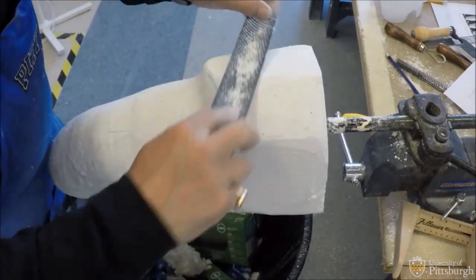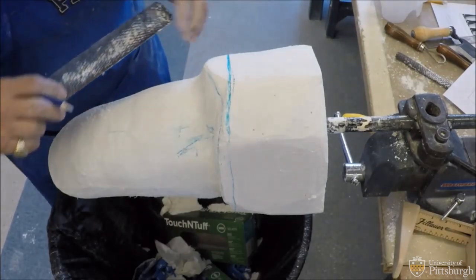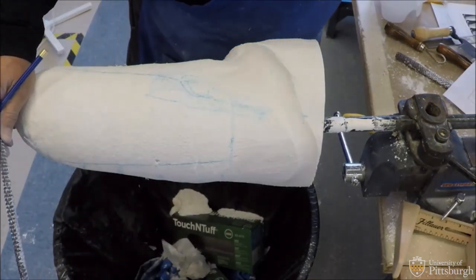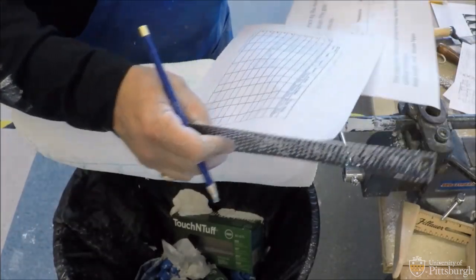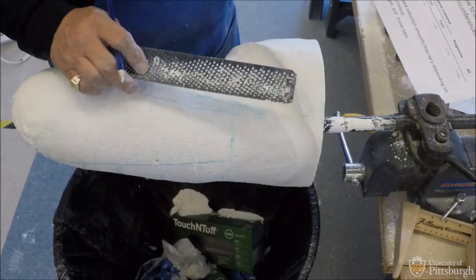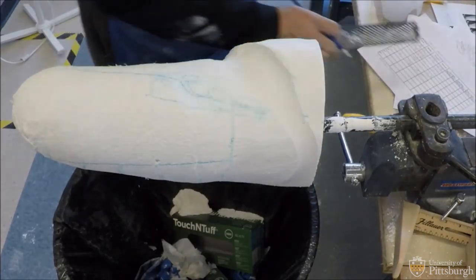At this particular point I like what I see. I'm going to reestablish my trim line back here on my posterior shelf, and I'm going to hit my global reductions at this particular point. My targets are marked on my worksheet. Depending on which liner you use, you'll follow their specification, just like we did on transtibial. I used Ohio Willow Wood in the progressive five to seven percent reduction. I'll look to my worksheet and find out what my targets are.